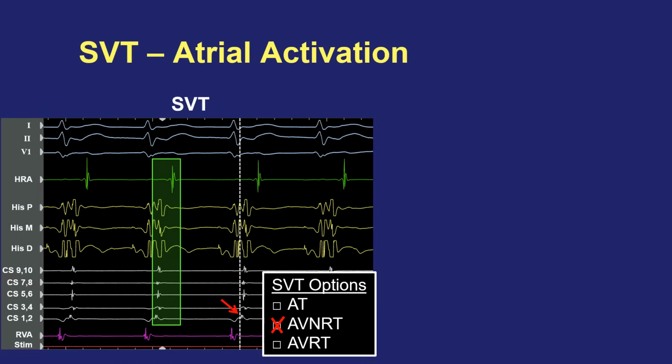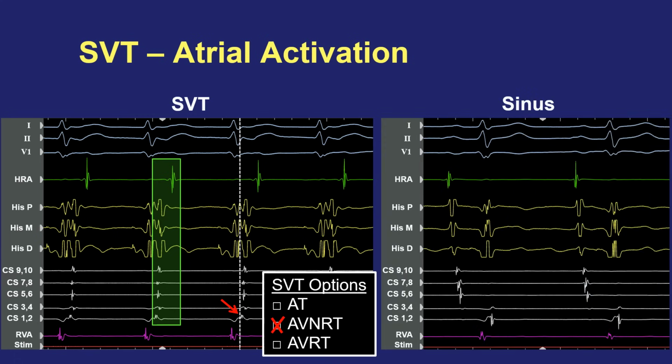This patient actually went into tachycardia as catheters were being placed, so we started our recordings after tachycardia had already been ongoing. But this tachycardia spontaneously terminated, which gave us an opportunity to then look at these same electrograms during sinus rhythm, which ordinarily is the thing you would do at the beginning of any EP study. When the patient reverted to sinus rhythm, we took another look at those coronary sinus sharp signals, and we made an interesting observation. Look here at this sharp signal in the coronary sinus when you're back in sinus rhythm.